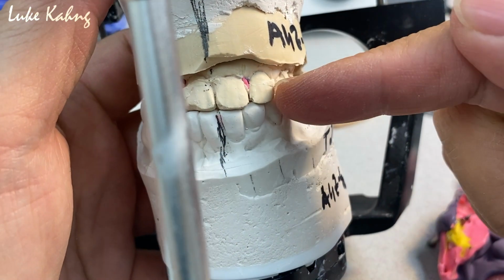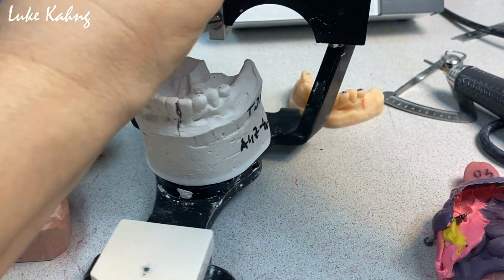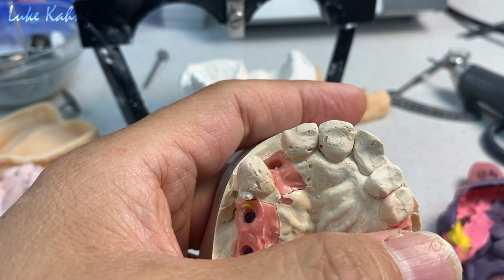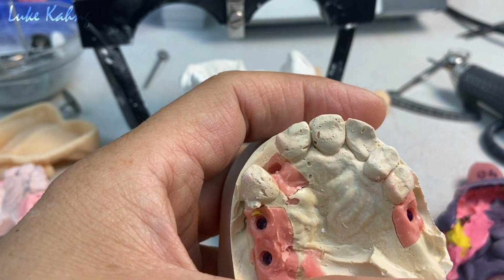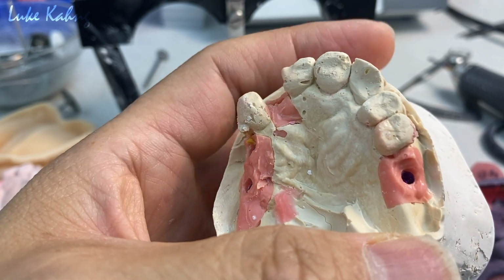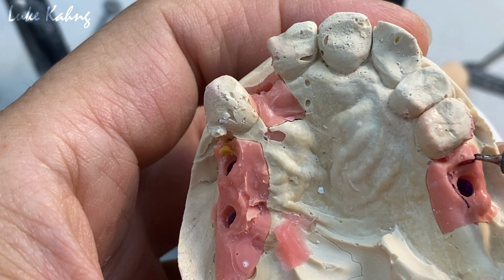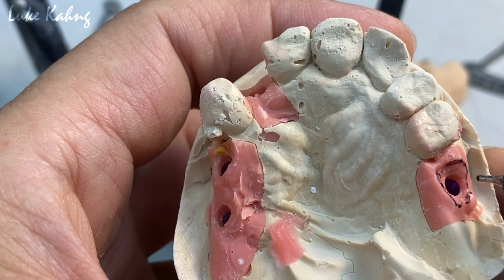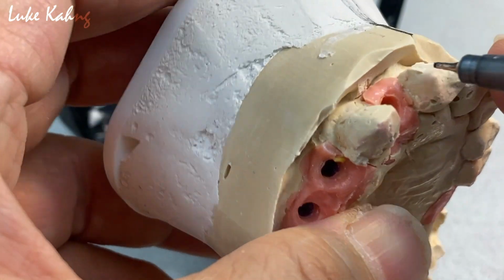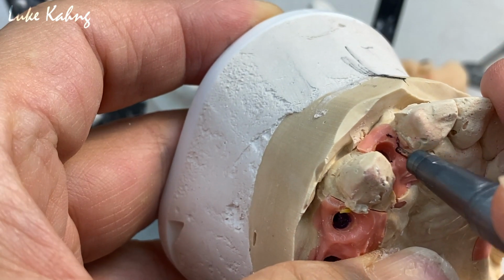now I'm going to hold out these teeth in order to make the one full mouth provisional case. Right, so the key is here. I have to draw regarding the tissue size. Here is nice, but I can grind a little bit more for the premolar, which is a rectangular shape. So I can grind more and make more hygiene effect. Now this is more ground to make better positioning of the lateral.